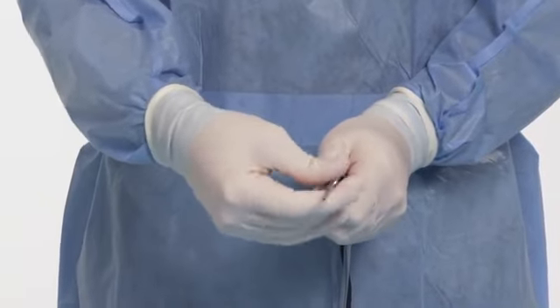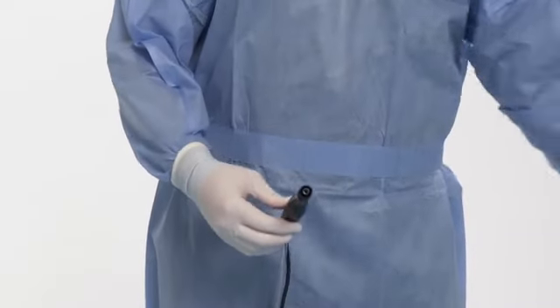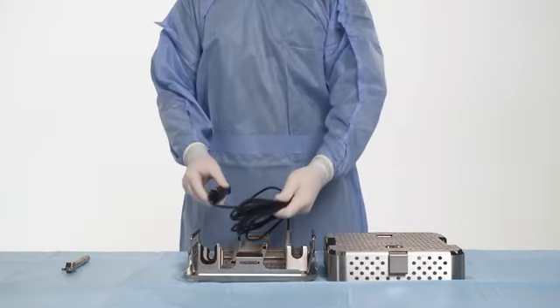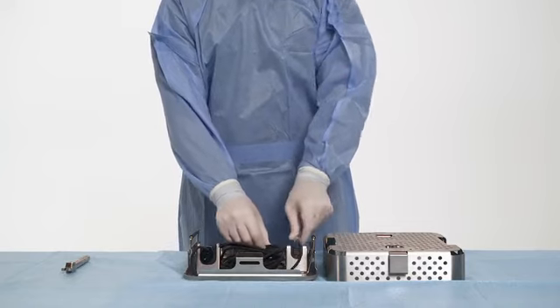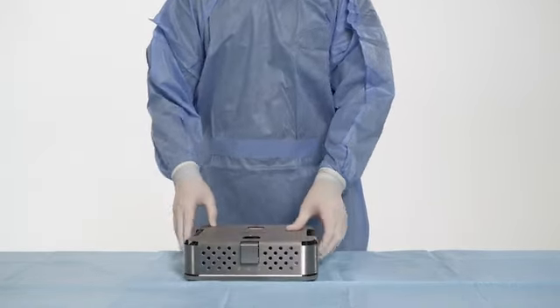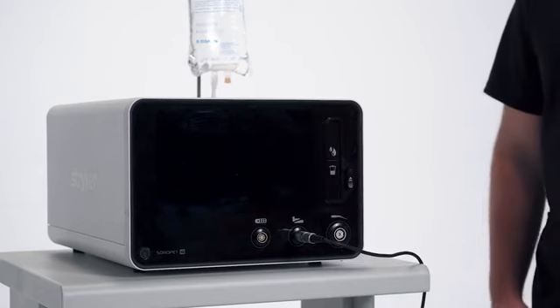Manually remove the tip from the handpiece and dispose of the single-use tip into an appropriate container. Separate the handpiece cable from the cable clips and disconnect the handpiece tubing connector from the handpiece. Load the handpiece and torque wrench into the Sonopet IQ sterilization tray. Press the eject button on the console and remove the irrigation suction cassette from the console.